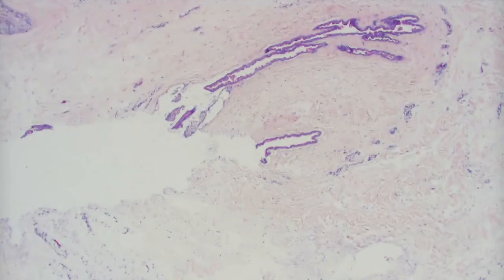Well, there was just one in the cut. I'm assuming that's probably the same one. Yeah, it's possible. This might be a couple together. I don't know. Well, if it might be a couple together, then maybe multiplex. You don't really need to know that for the boards, but the fact that you recognize this is important.